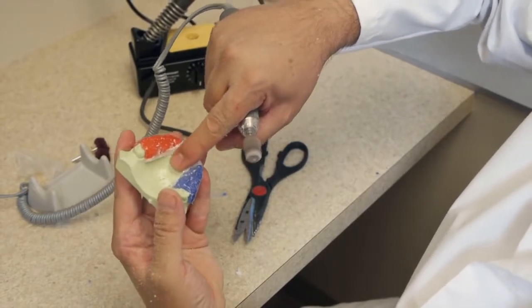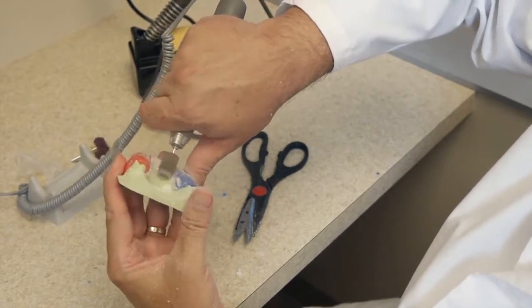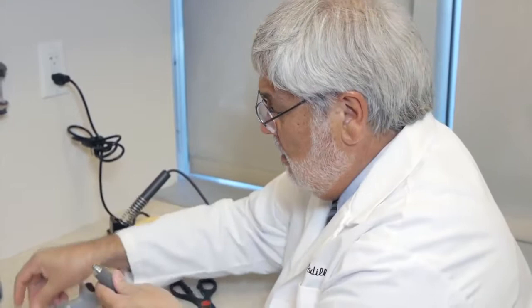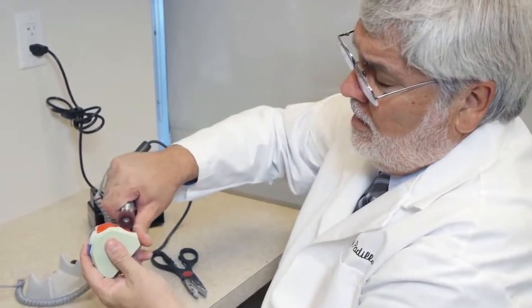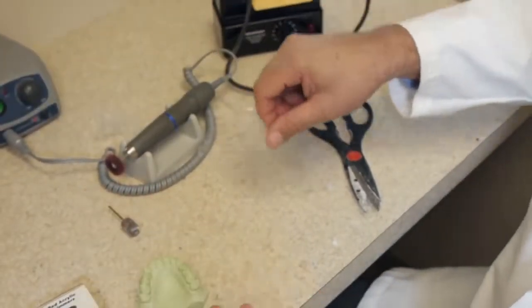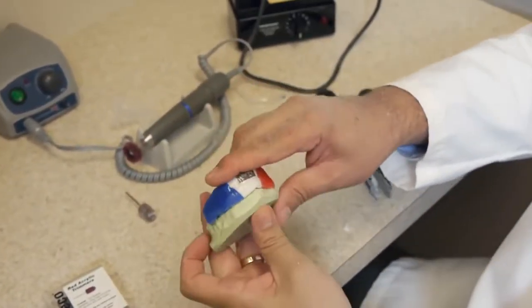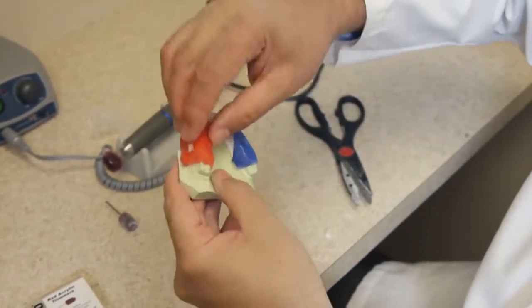Now when I run my finger back here, I don't feel a margin. It should feel flush with the model. Now I'm going to switch to my final polishing brush, and do my final polish. There's my mouth guard, properly trimmed, no margin, very, very comfortable. Now we're ready for the final polish.